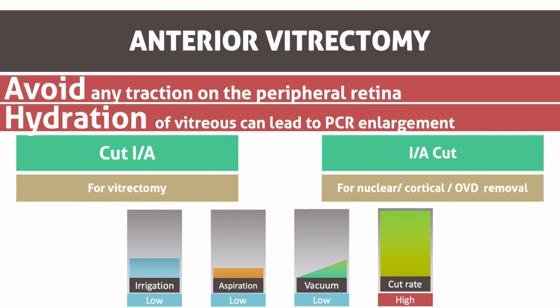But in reality, we need to cut, then aspirate. Also, when we cut the vitreous and then want to move to another place to do further anterior vitrectomy, we have to move slowly while pressing on cutting on step 2 to cut any vitreous on our way.